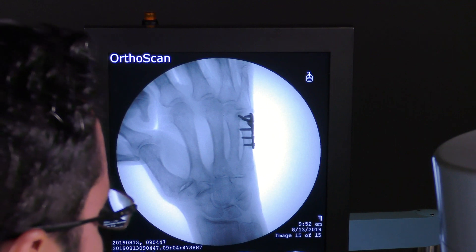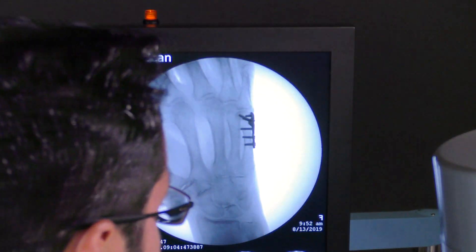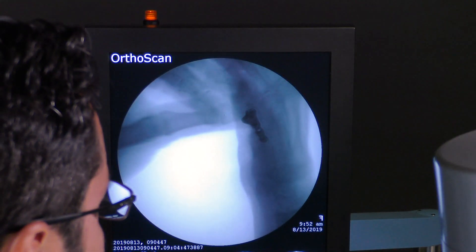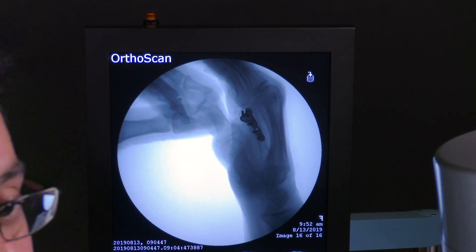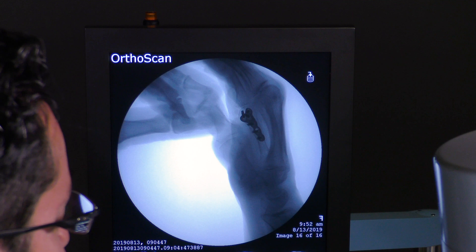So we did take that one screw that we used for the reduction screw. It doesn't serve a purpose anymore. And check out its position there as well. It looks great in terms of all screws in the head. No screws are bicortical.